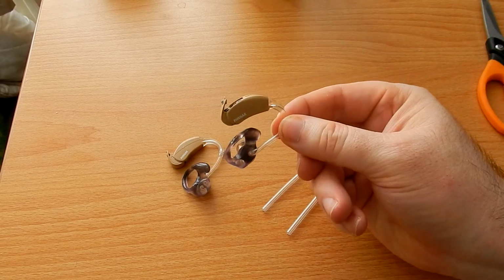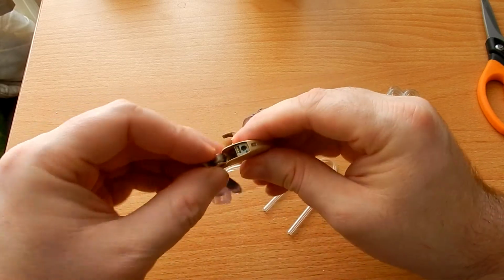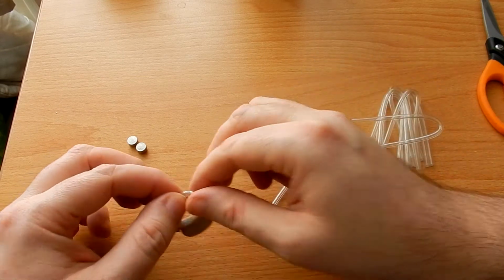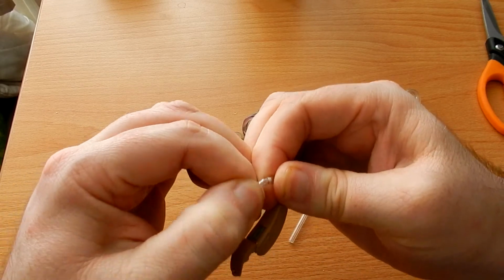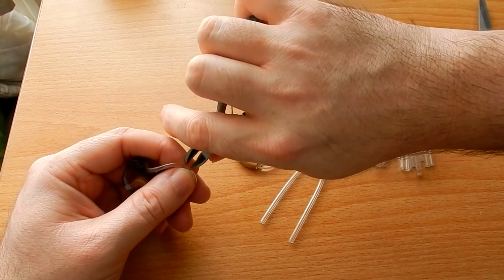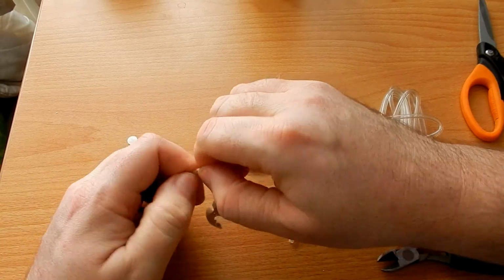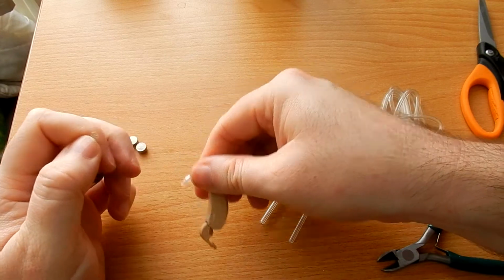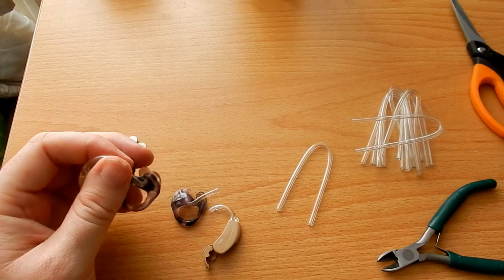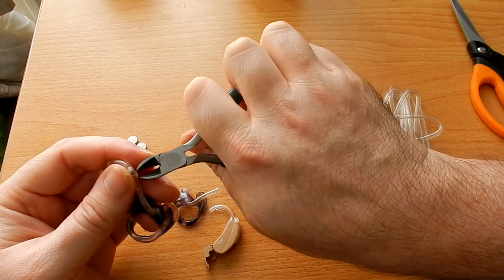Firstly, we've got to remove the old tubing. First off, I'll remove the batteries. Then we try and remove the tubing. As they're old and stiff, I will have to just nibble away at the edge so that it can come off, like so. Do that on the other mould.